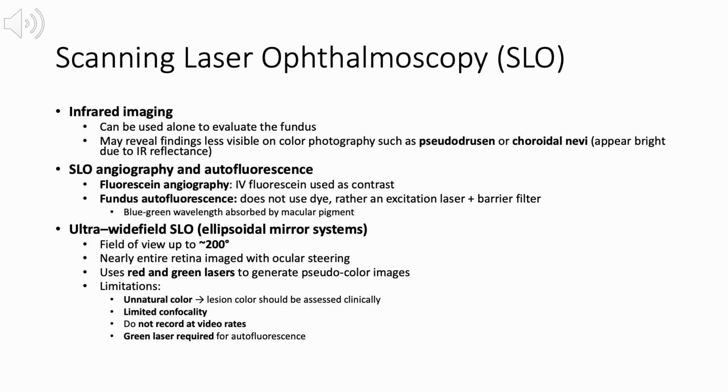Building on the core principles of scanning laser ophthalmoscopy, or SLO, specific SLO modalities further expand diagnostic capability. Infrared imaging can be used alone to evaluate the fundus and may reveal abnormalities that are less visible on color fundus photography. Findings such as pseudodrusen or choroidal nevi may appear bright on infrared imaging due to increased infrared reflectance. Scanning laser ophthalmoscopy also supports angiography and autofluorescence imaging.